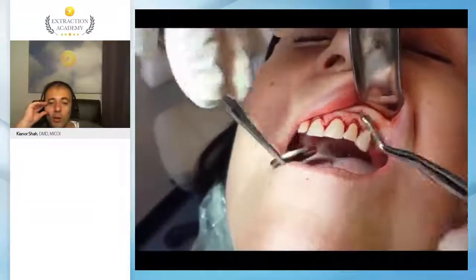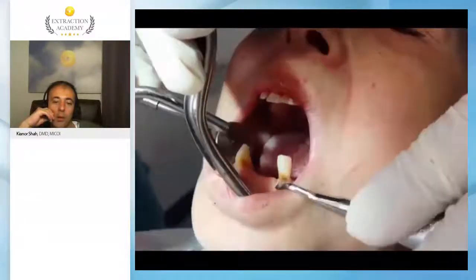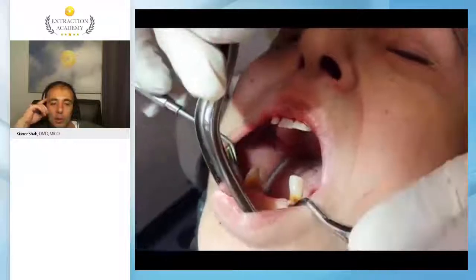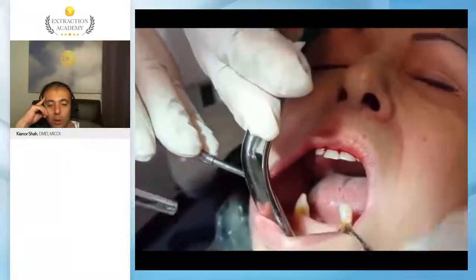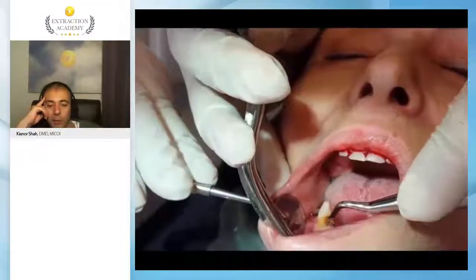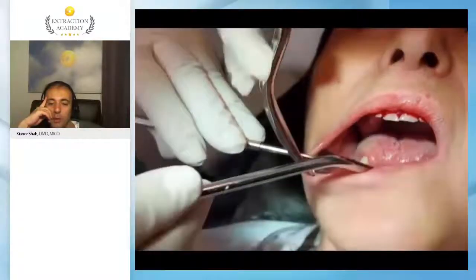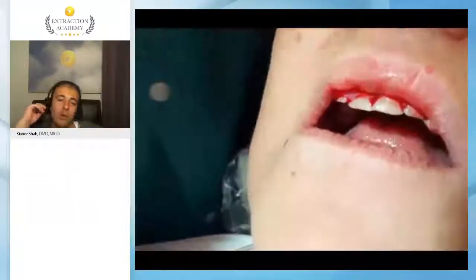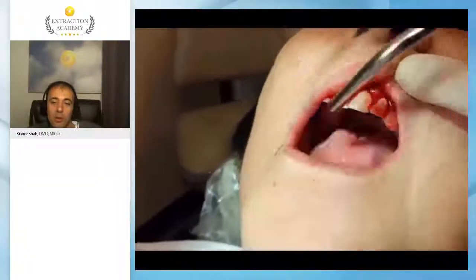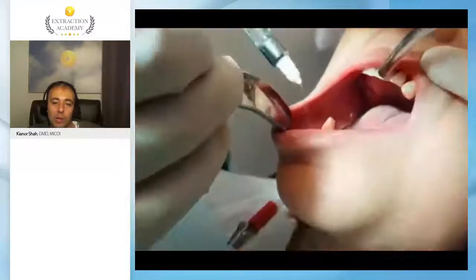And you'll also see how in cases you can separate the papilla nicely with an arrowhead, and how you can also do clean work with extractions. Now, lone standing canines, unless they're periodontally compromised, they will show quite a bit of a challenge at times. But every tooth is different. What may appear to be an easy extraction case on an x-ray may as well not be an easy extraction case at all. It may be quite challenging to do the case.